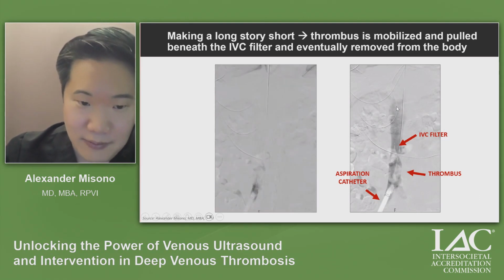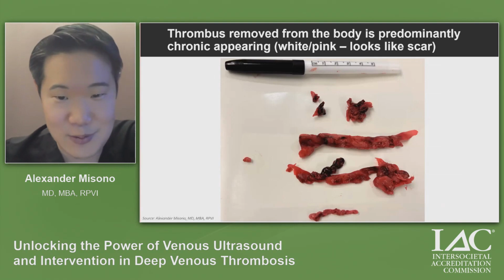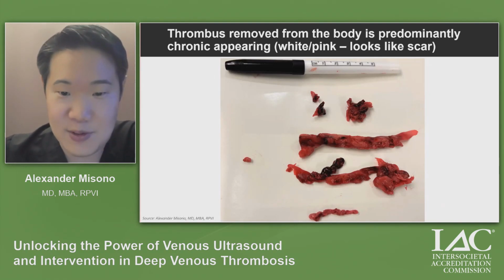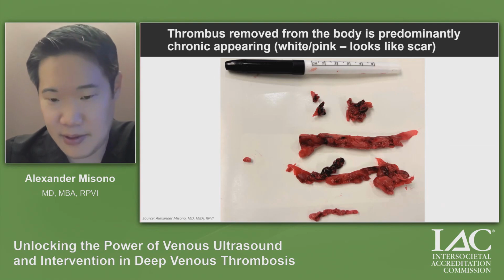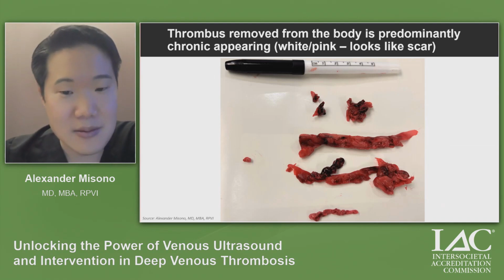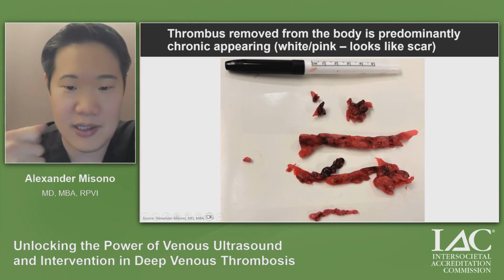And so I was able already to move that DVT from above the filter to below the filter. And then ultimately, with some additional steps I will spare you because it's just additional work and plumbing, I removed this material from this patient. This material scares me. It scares me because it could have easily been missed on sonogram. It scares me because anticoagulation, which the patient would not have even begun because they would not have been caught, would not manage a patient like this, because this material is basically fibrous rubbery scar.